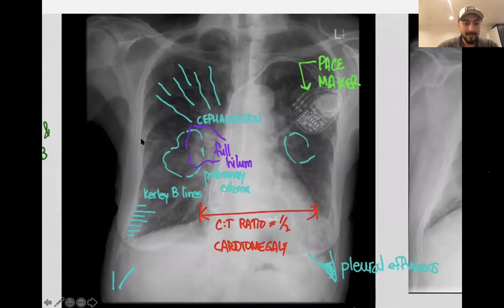That's why it's on the edge. It's always on the edge, and it is very narrow and it's very small. It's 1 to 2 centimeters in length.